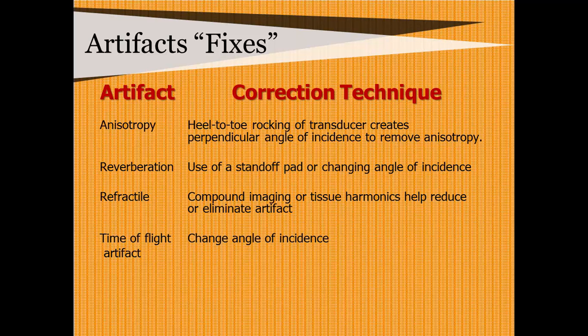So how do you fix these artifacts? Well, anisotropy, you can heel-toe, rock the transducer. You just want to maneuver the transducer to make sure that it's perpendicular to those fibers. Reverberation, you can use a standoff pad, or you can change the angle of incidence.